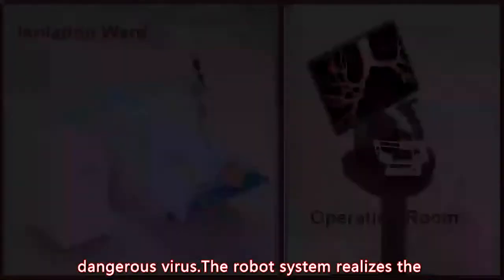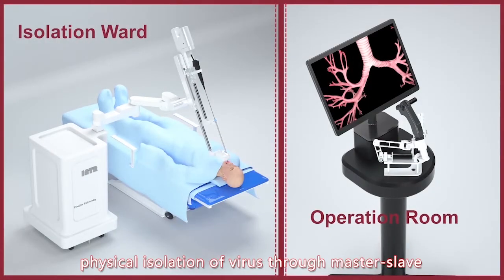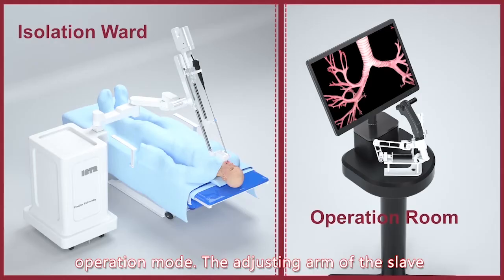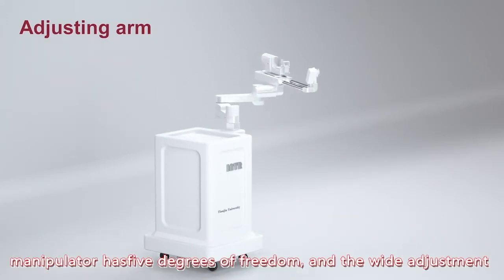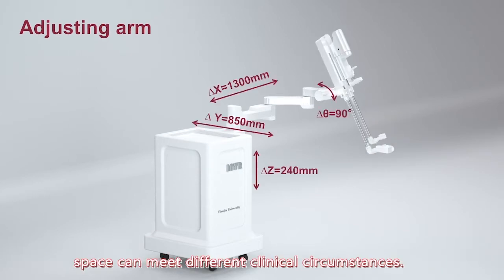The robot system realizes the physical isolation of virus through master-slave operation mode. The adjusting arm of the slave manipulator has 5 degrees of freedom, and the wide adjusting space can meet different clinical requirements.